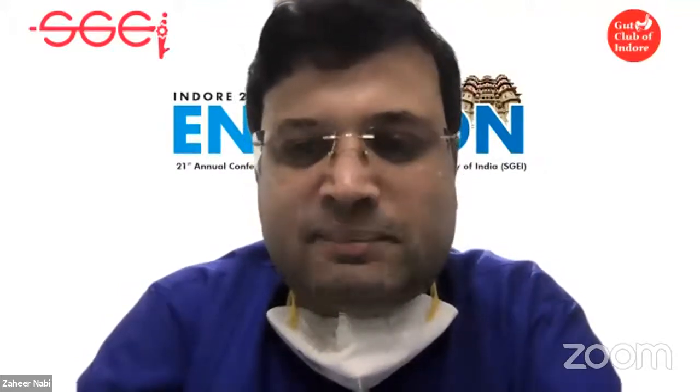And RDI is, as of now, useful to identify the bleeding site. RDI 1 is the most useful mode as of now. The utility of 2 and 3 are yet to be seen in routine clinical practice. And EDOF, definitely it may reduce your learning curve, but it does not replace your meticulous screening, as Dr. Raj said.